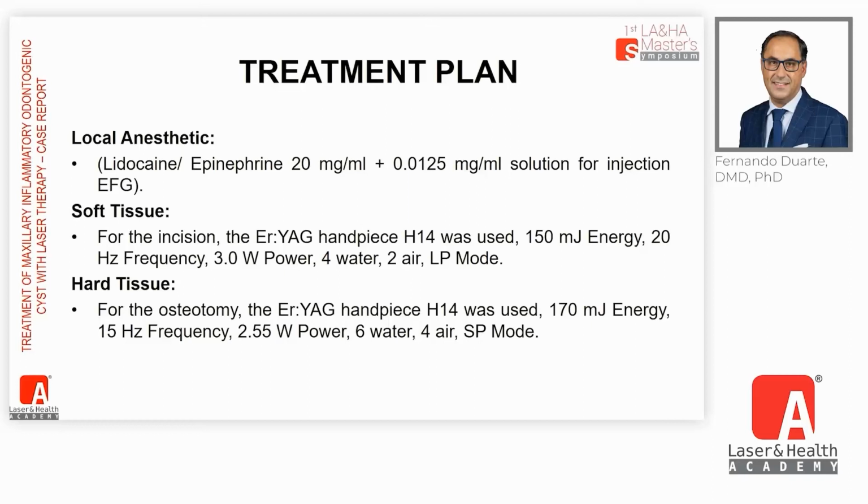And for the hard tissue, for the osteotomy, we also use the erbium YAG laser with the same handpiece, but with a little more energy: 170 millijoules, 15 Hz of frequency, 2.55 watts of power, and the combination was 6 of water, 4 of air in the SP mode.